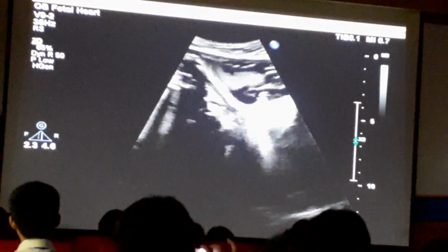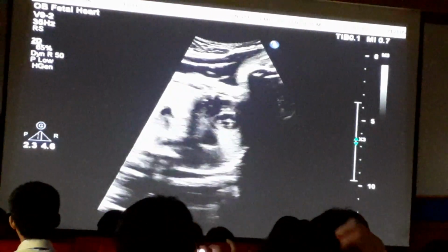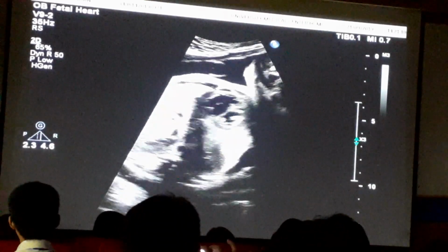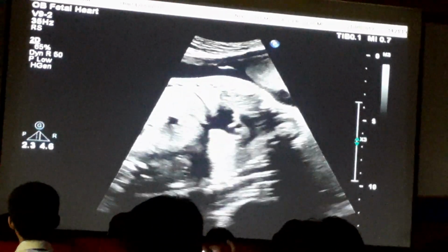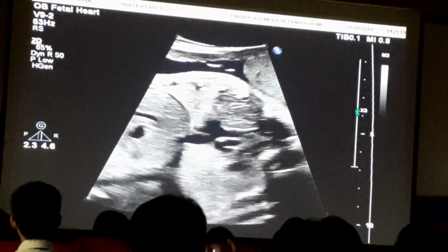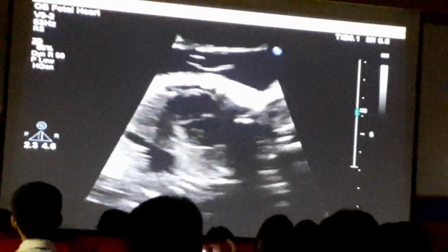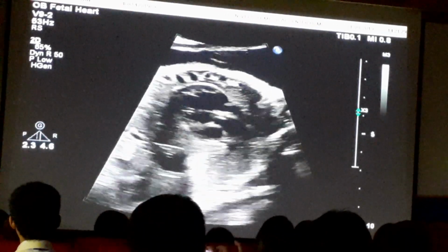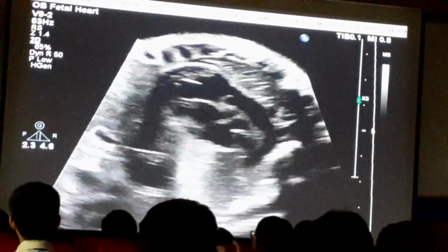We're starting to use maternal hyperoxia in the 3rd trimester for hyperoxia testing to see if that helps us to predict which patients are going to need a balloon atrial septostomy after birth. Ở chỗ UCSF thì bắt đầu để dùng cái test gọi là cho mẹ thở oxy liều cao để coi thử cái đáp ứng của cái lỗ bầu dục như thế nào, để mà làm tiên lượng thử đứa trẻ nào sau sinh nó sẽ khả năng là phải phá vách liên nhĩ bằng bóng. Thì cái đó là cái nghiên cứu.